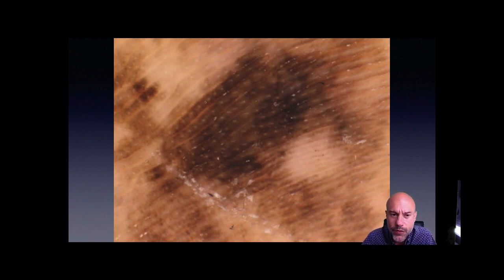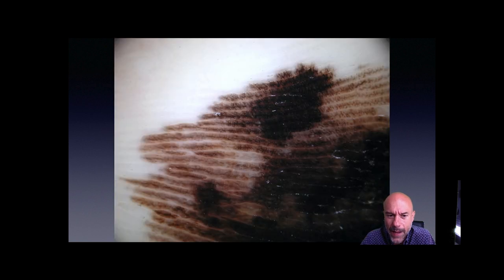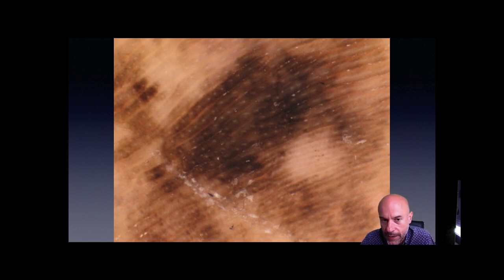Concerning the parallel ridge pattern, it is usually easy to recognize because the pigmentation is located on the ridge — the brown lines are much thicker than the non-pigmented ones. We can also see the openings of the eccrine ducts, which are always located on the ridge, and they help us locate the ridge.